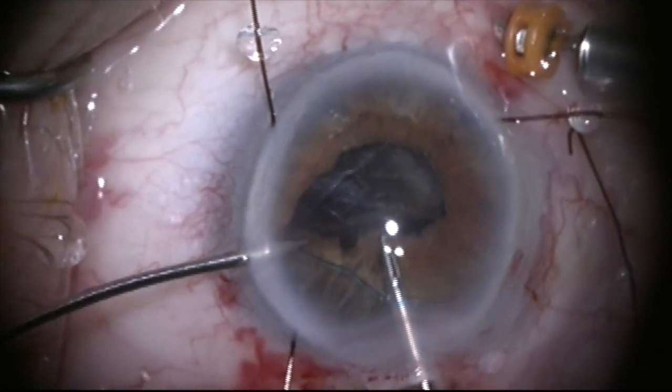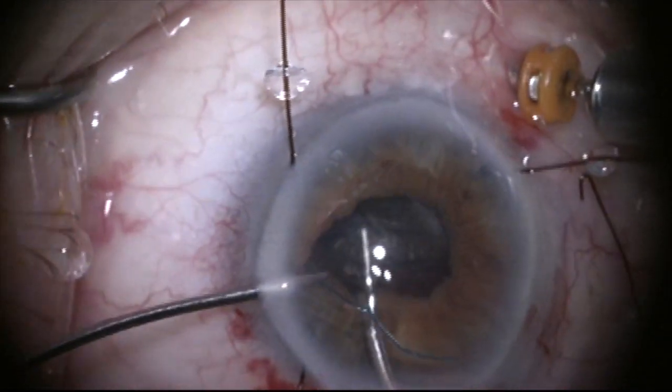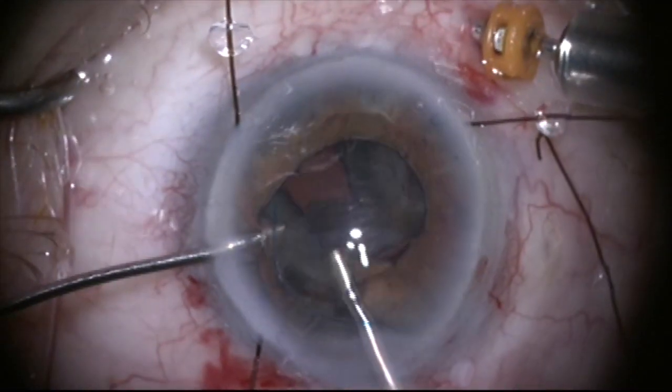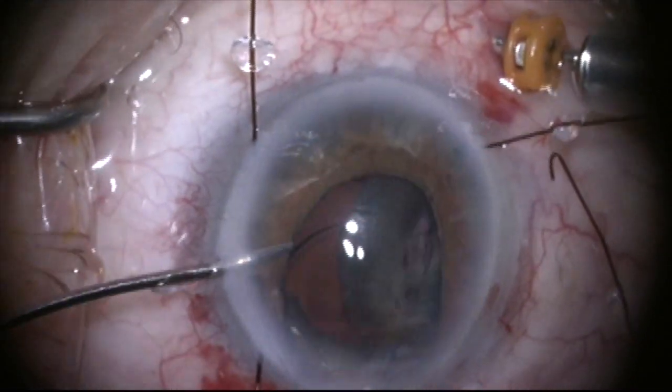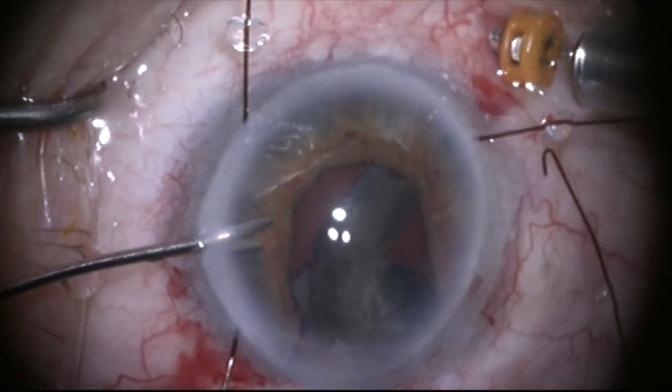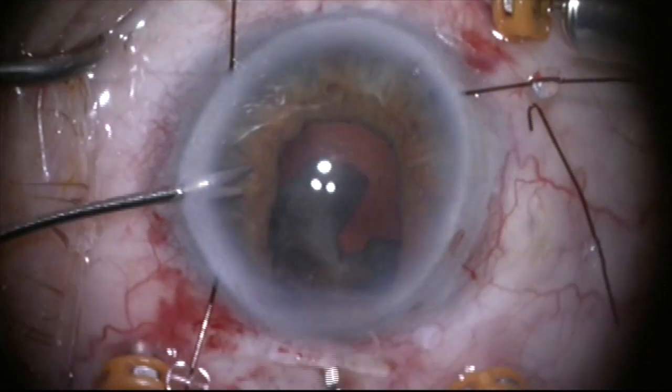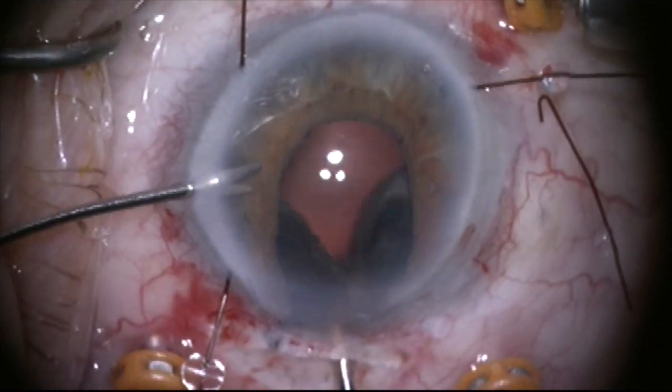So what I'm going to do is remove that iris retractor and now hold the haptic with my left hand while I grab the optic with the right hand through the main incision and pull this out in one piece. Unfortunately the Soemmering's ring is too large to come out with the lens so it gets trapped behind.